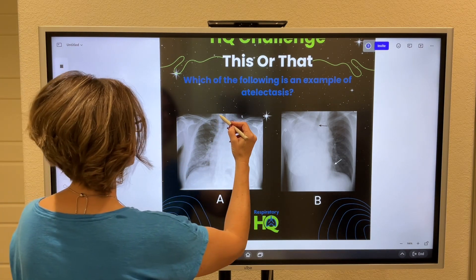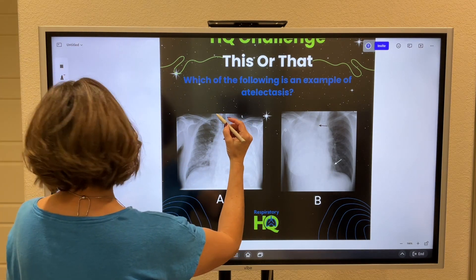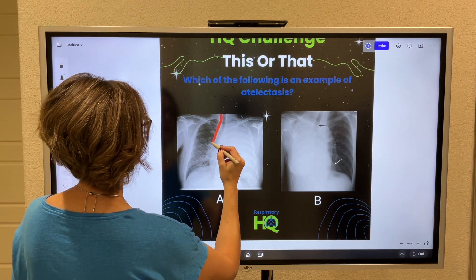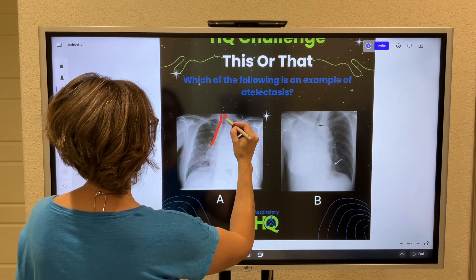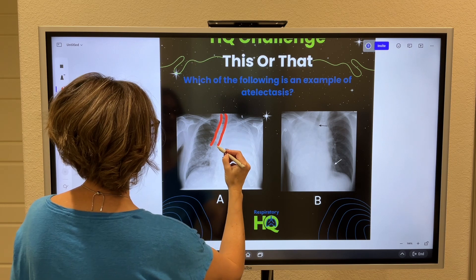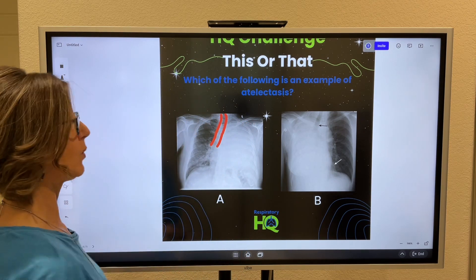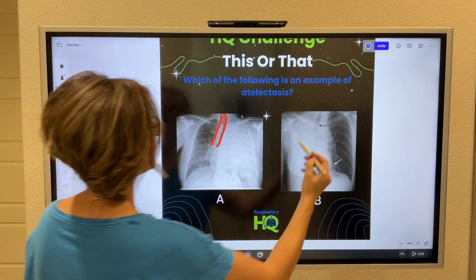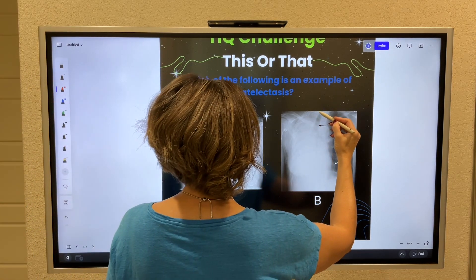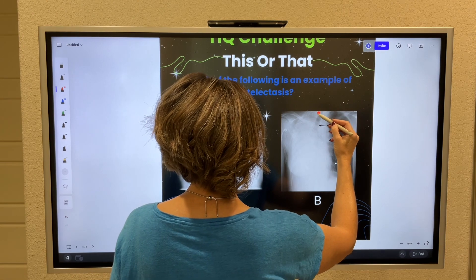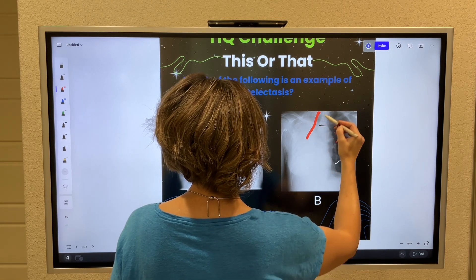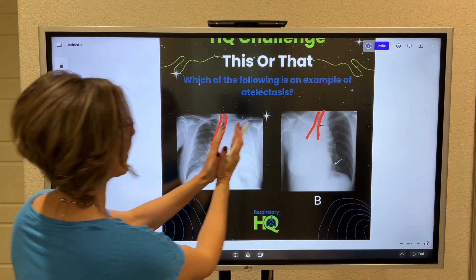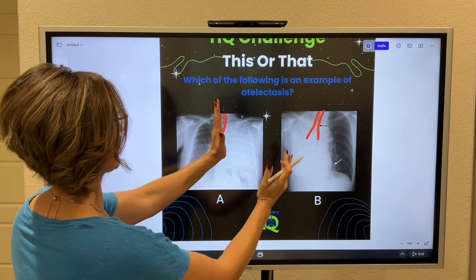If you look at this one, I'm just going to draw the trachea for you — outline the trachea. There's the trachea, and it's shifted away from midline. And in this one, you also see that tracheal shift away from midline.